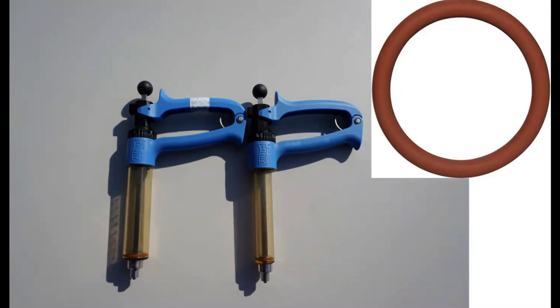One thing to be aware of with these is they do have an O-ring, and there's two different styles. So this particular brand, that plunger in the inside of the barrel, on the end of it, it has a groove that this O-ring will set in. Some other brands, the O-ring will be much more filled in with just a very tiny hole in the middle that you actually have to tighten. There's a place on that plunger that you pull back, you can actually tighten the two little plates on each side of that O-ring to tighten it down. So that's something to be aware of.